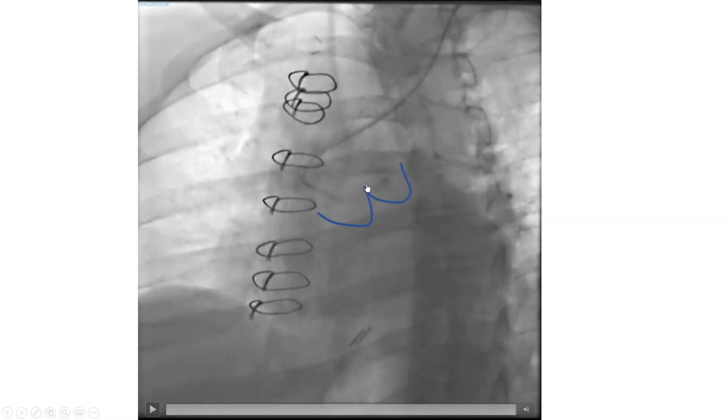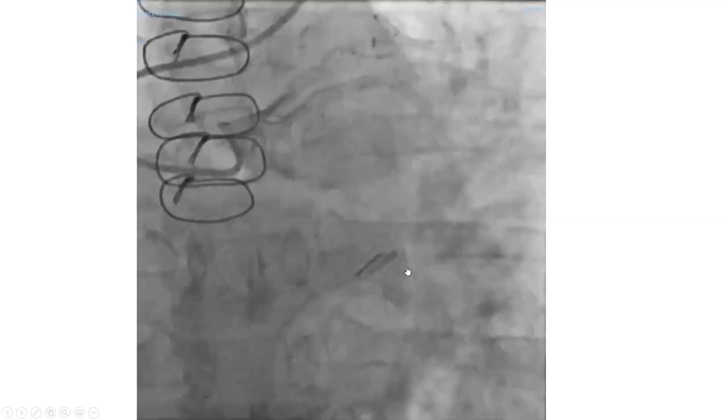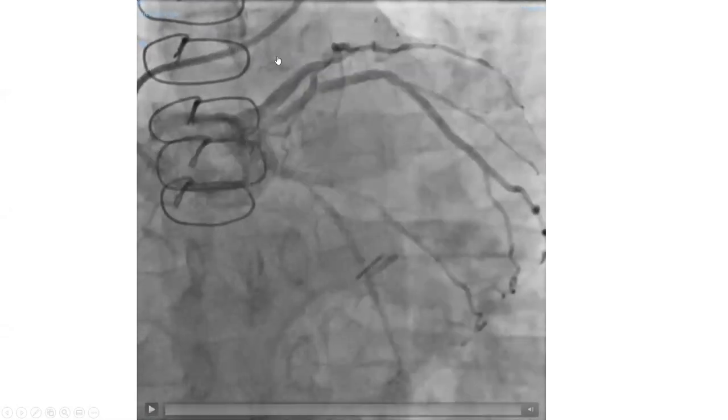Always as you're maneuvering — especially in difficult cases and in all cases — imagine right cusp, left cusp. That's a key idea you need to embed as a reflex. Here is an image showing how we engaged from below and got good images. That was really a tough angulation.